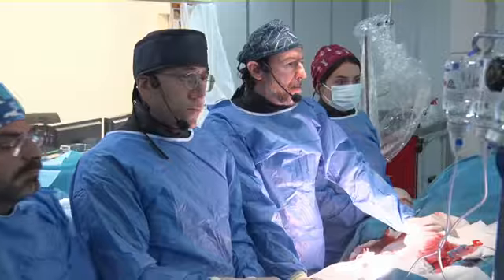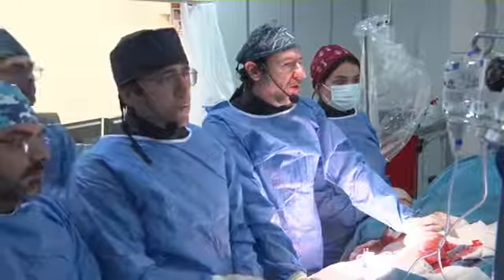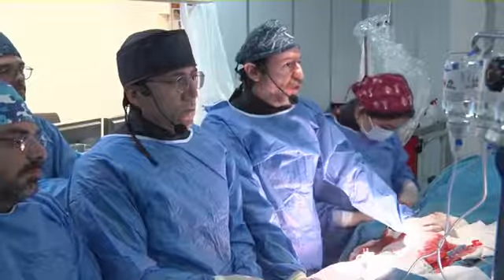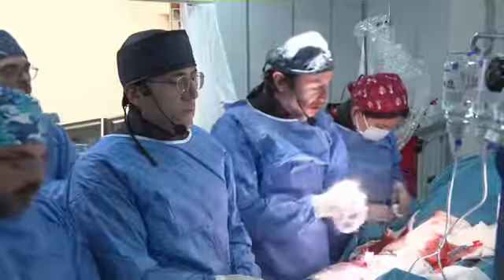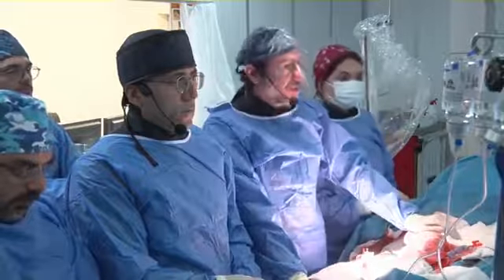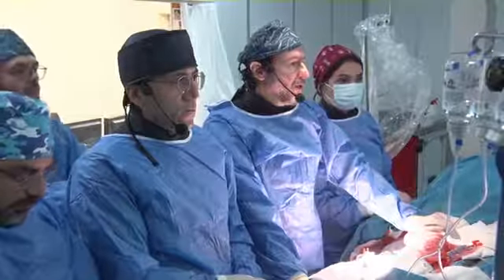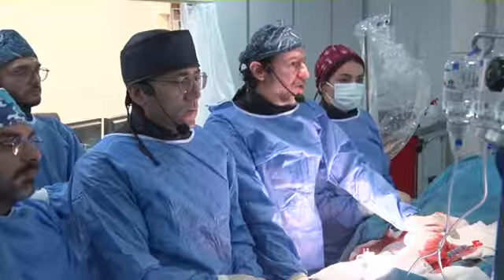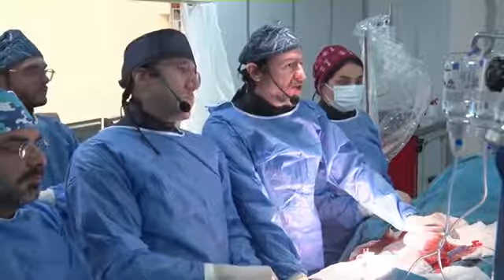Our beginning was therefore retro because this was the only option here. We didn't take too many views of the patient because of the ejection fraction of 30, the previous heart failure history, and the renal failure problems. With this low ejection fraction, I don't have many options here. So that's a little bit distressing and annoying.